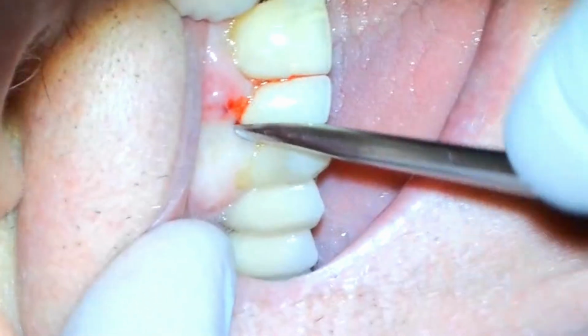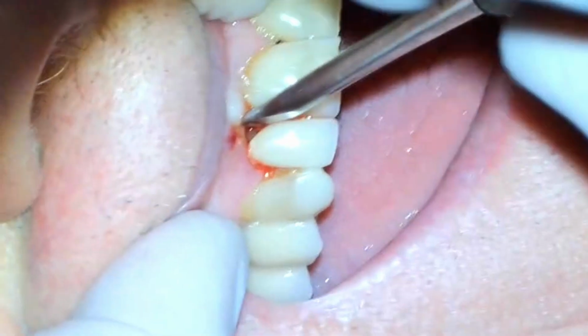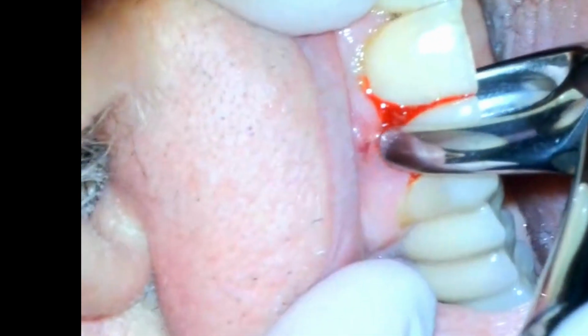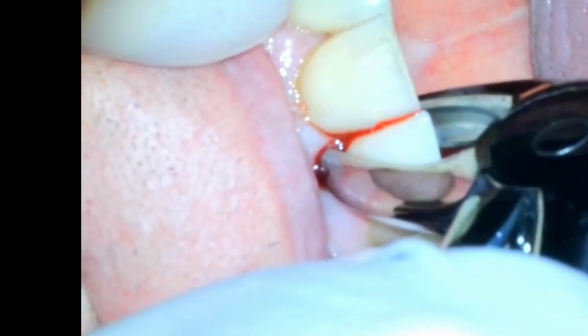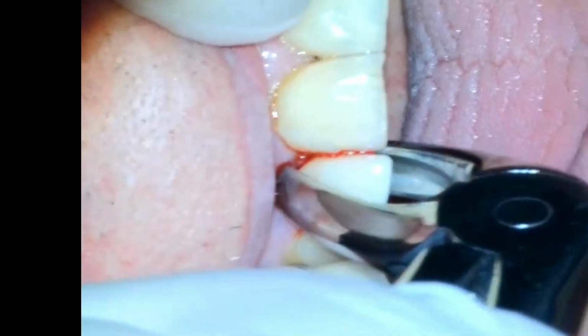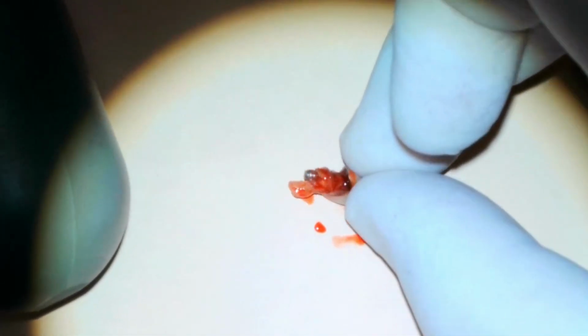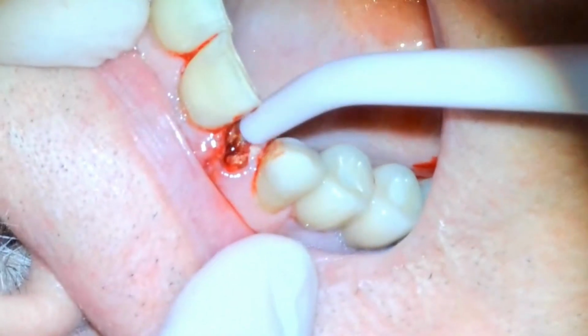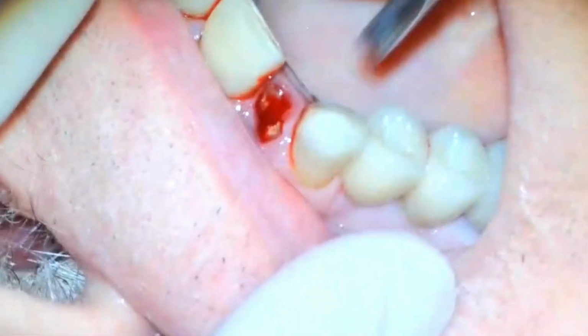So as you can see, there's not a lot of room to try to get the tooth out. I'm using my straight luxator, and I just don't have any space for it, so I'm going to grab my ash forceps and just remove the top part of the tooth, basically the crown and the post, and we'll see what else comes up. Sometimes you get lucky and the whole tooth comes out, but in this case, no. There you can see the post and what's left of the broken root there. Pretty messy. Let's vacuum that up with my surgical suction tip. You can even see where the root canal filling still is down in the root.